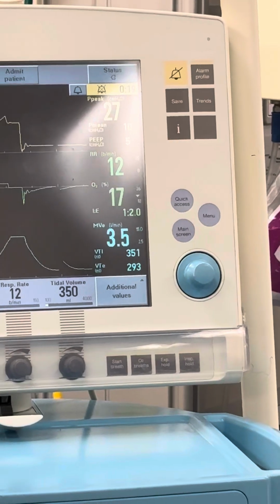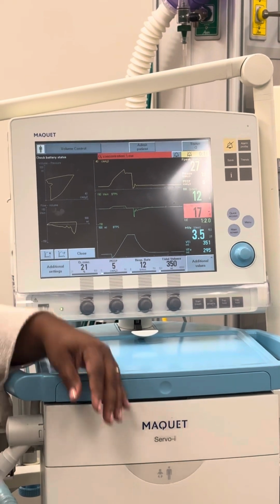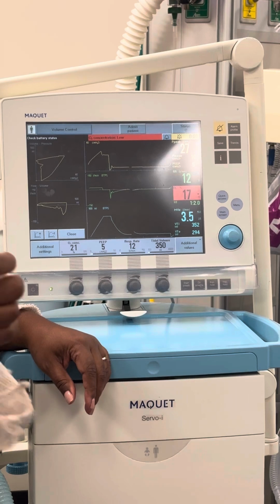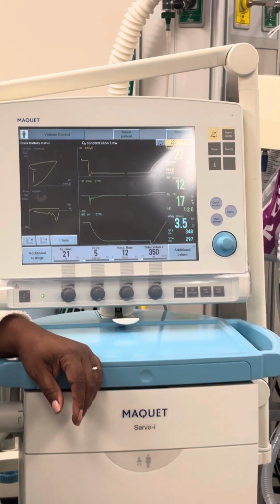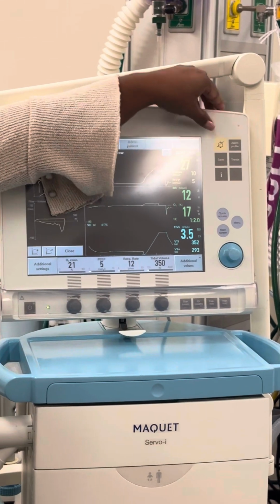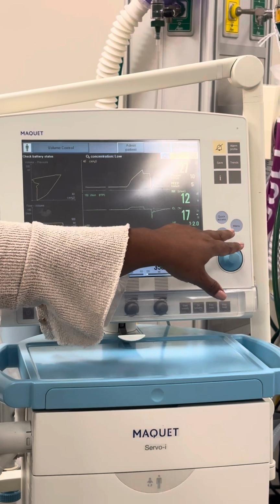And here, it's not going to give it to you. You have to actually coordinate it with your patient's breath. So you just have to look at them breathe and hit an inspiratory hold, and then the next breath the vent gives them, it will give you the number. You have to coordinate it with that breath. On that one, you can just hit it and it'll give it to you on the next breath. This one, you have to coordinate with the patient. Back to the pioneer days.